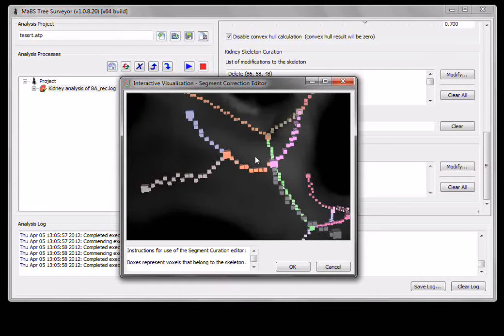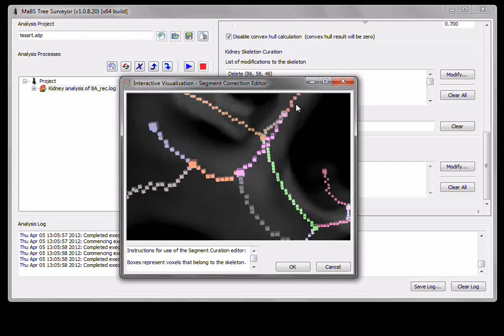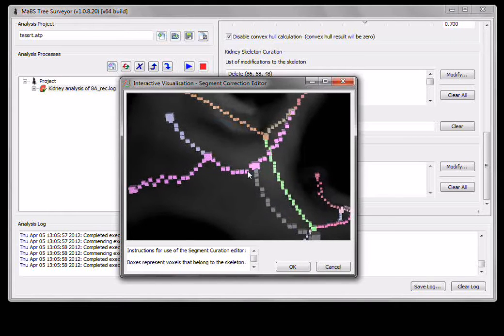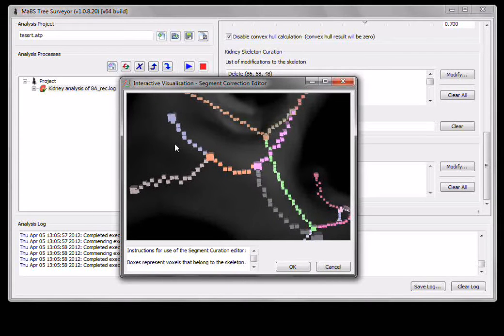That's actually very useful in a lung where you might have a bronchus, say for example an incoming bronchus which is actually quite linear, doesn't bifurcate in the same manner that this does. We can actually come through and select and turn individual branch points into continuous segments. I'll turn all that off, and yes, back to what I was talking about previously.